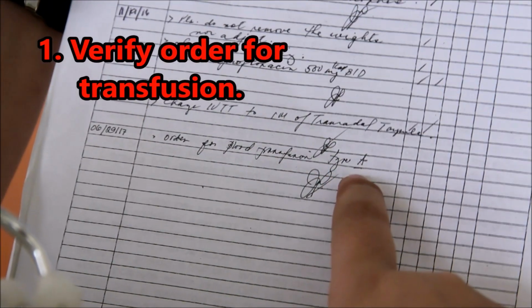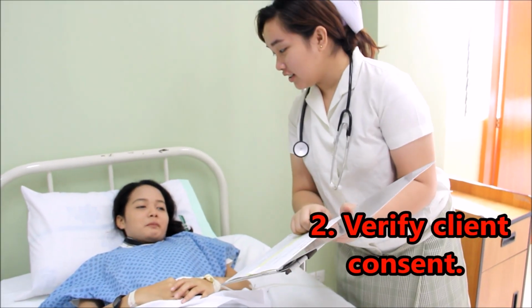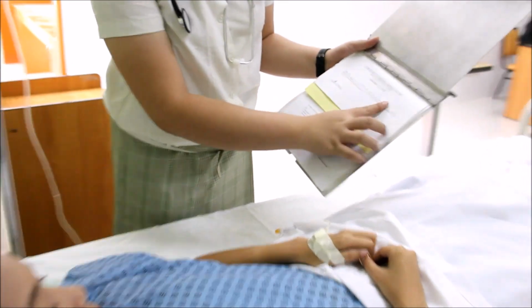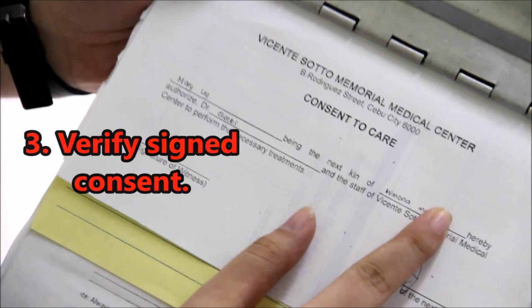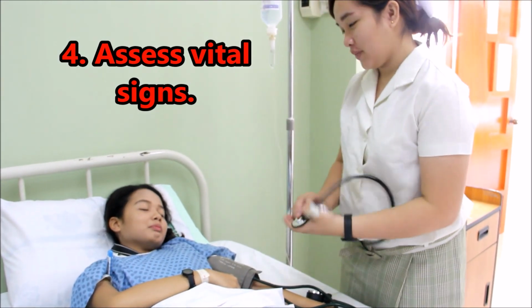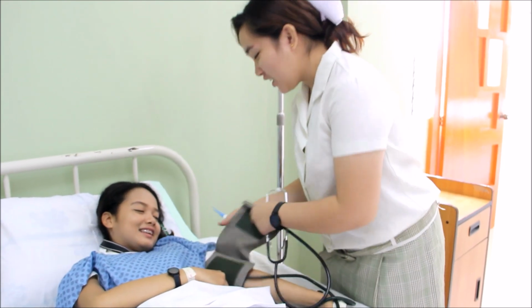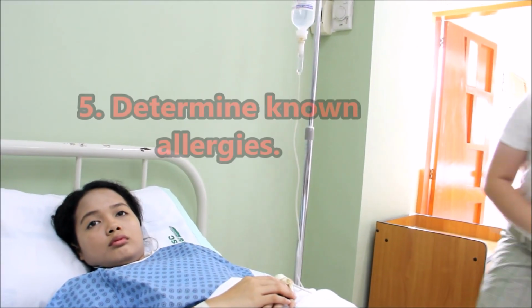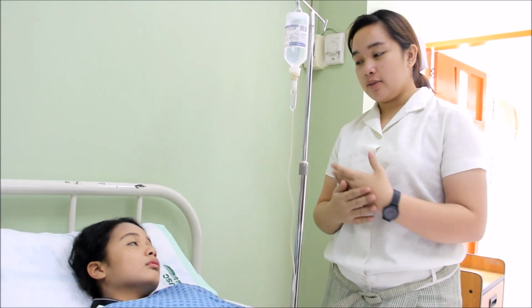Number 1, you have to verify the primary care provider order for transfusion. Number 2, verify client consent and obtain baseline data before the transfusion. Number 3, verify that a signed consent form was obtained. Number 4, assess vital signs for baseline data, including blood pressure, pulse, respiratory rate and depth, and temperature. Number 5, determine any known allergies or previous adverse reactions to blood.